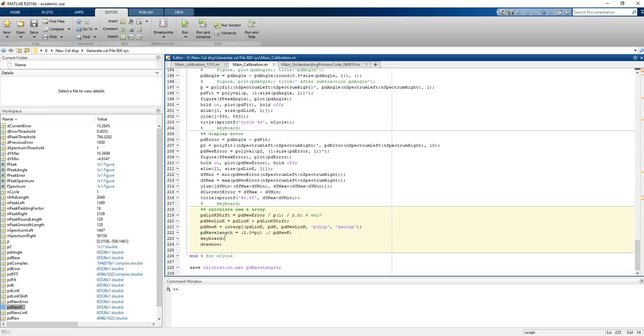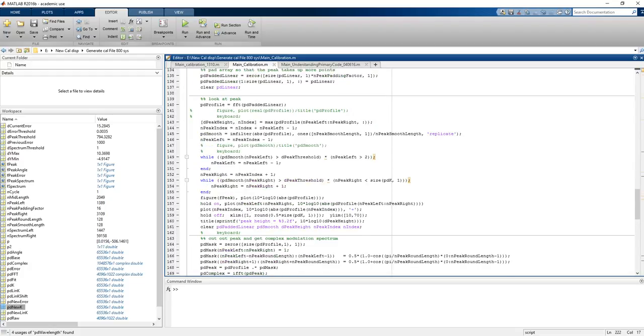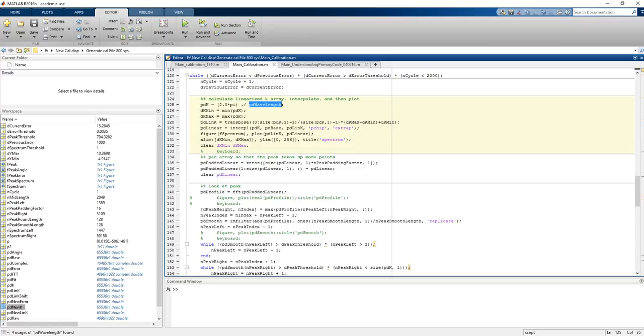This is the new k and this is the new wavelength, and this wavelength value will be used again here, just to go through all the steps.